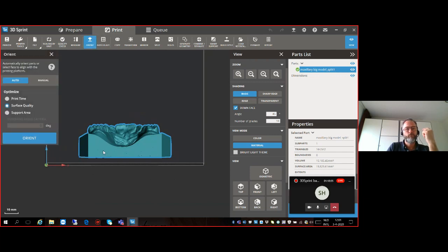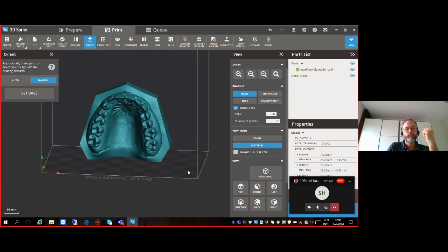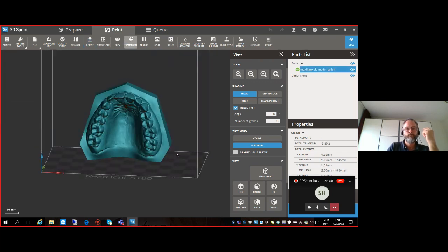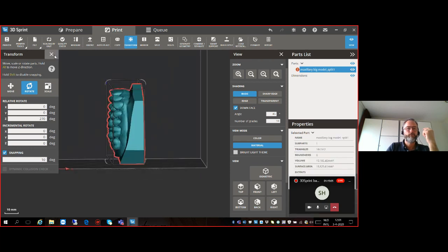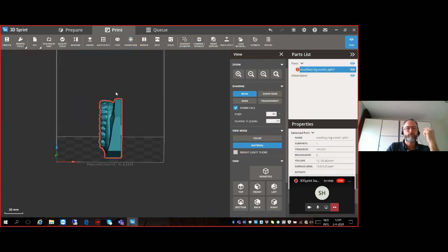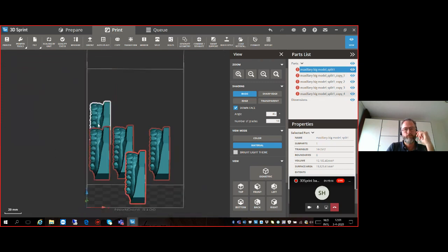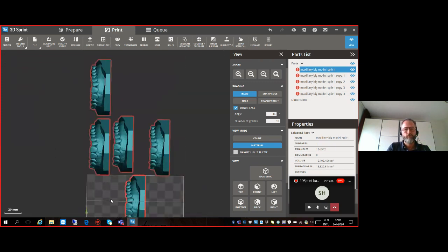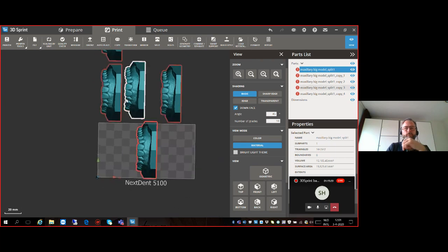We will have another webinar planned next week, so keep an eye on social media and our website. The webpage that you started from right now will be uploaded with a schedule of more webinars, and one of these webinars will be the new functionality in the upcoming 3D Sprint, where we will handle stacked printing for orthodontic models, but also some new features in denture printing and so on. So that's going to be very exciting as well.